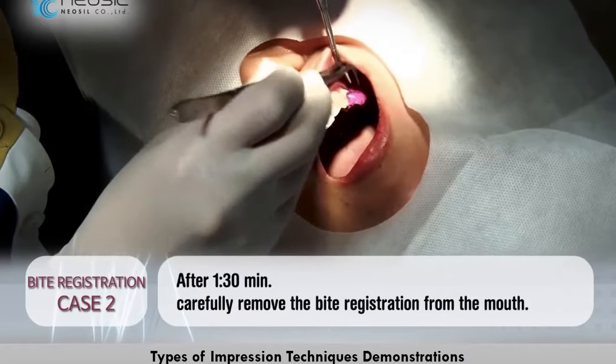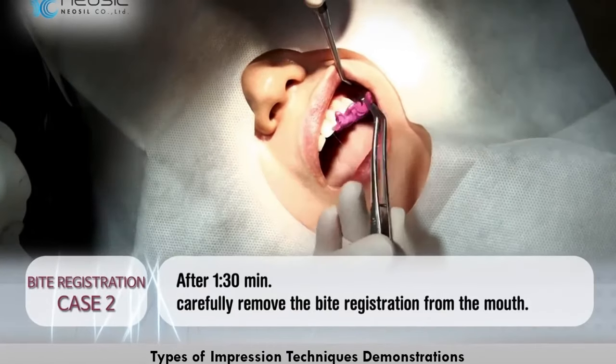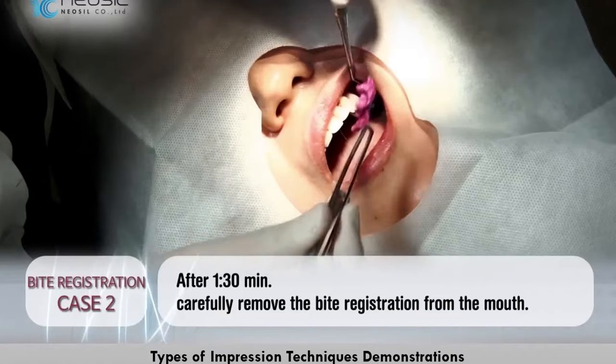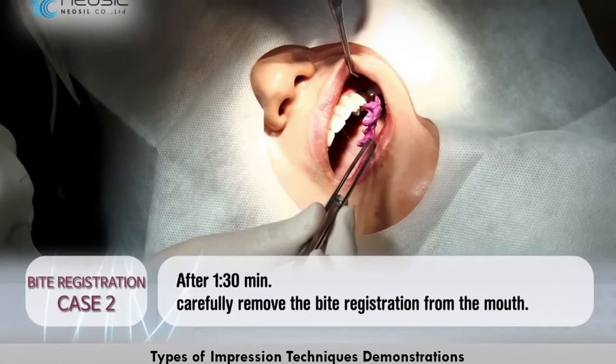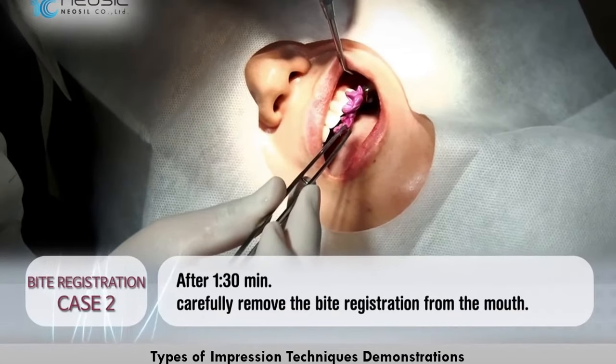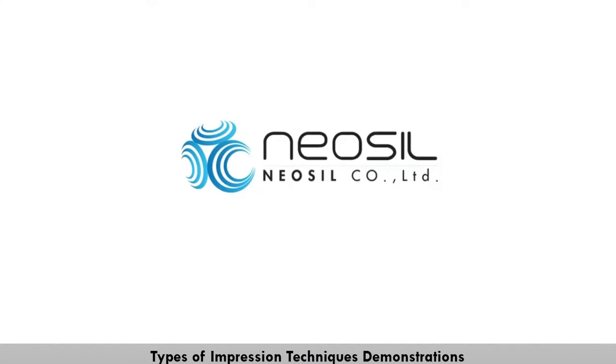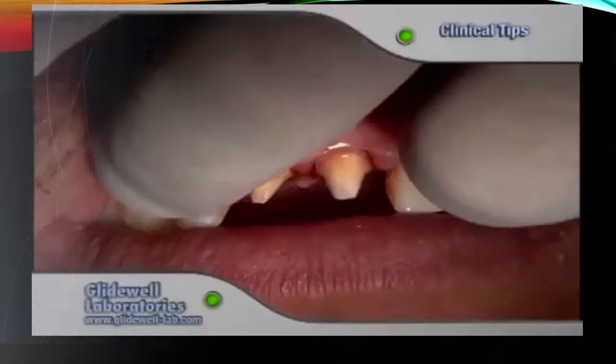Okay, we remove the bite and then we use this bite and send it to the lab so we can complete our work.